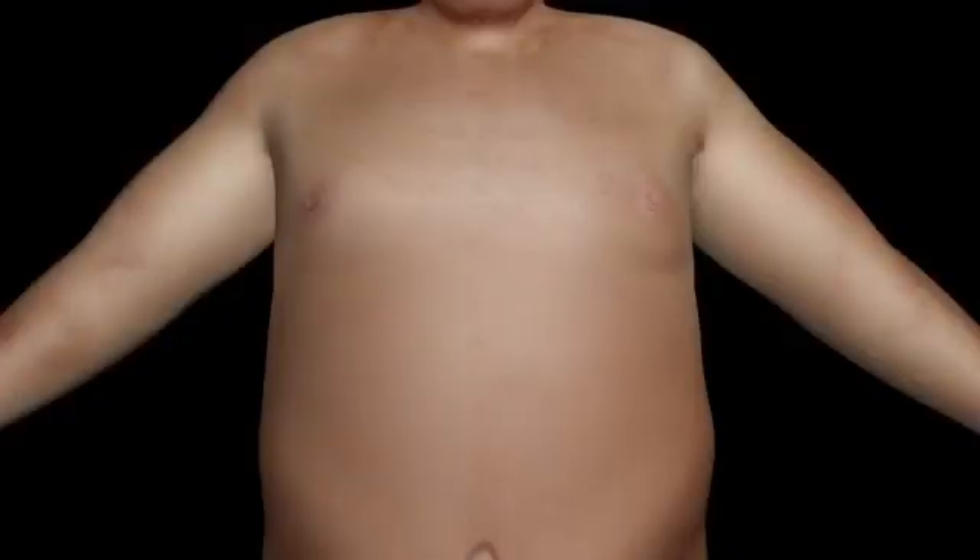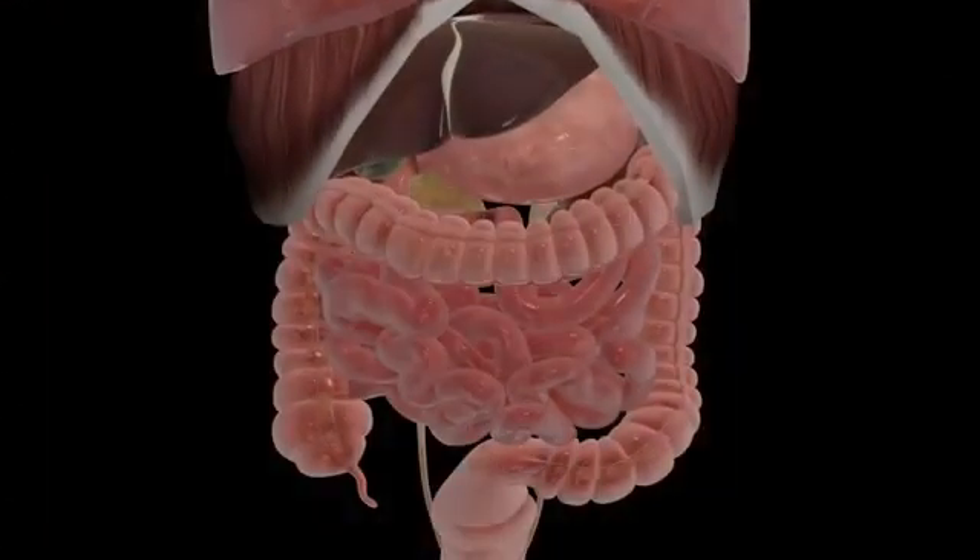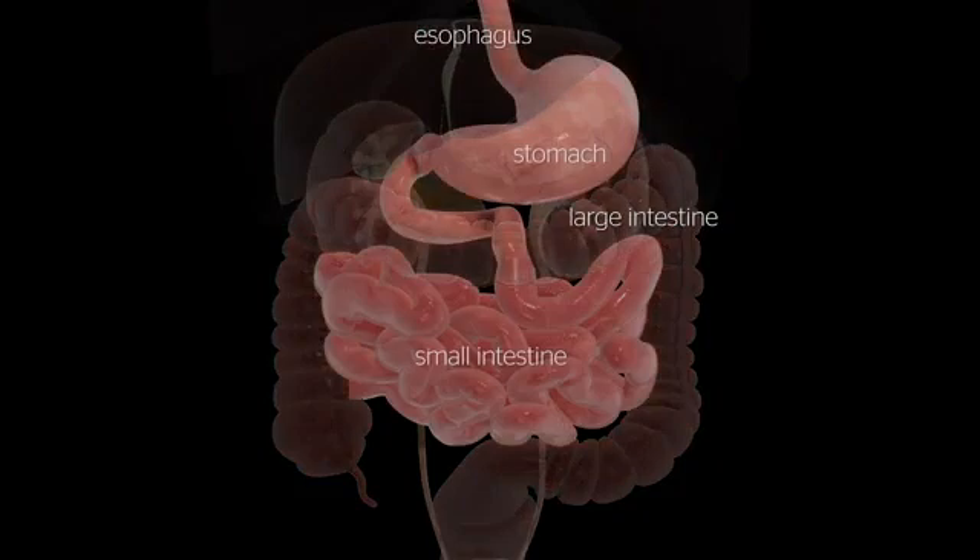To access the abdominal cavity, small incisions are created. Trocars are placed to serve as passageways for surgical instruments. The surgeon examines the abdomen using a laparoscope or video camera.